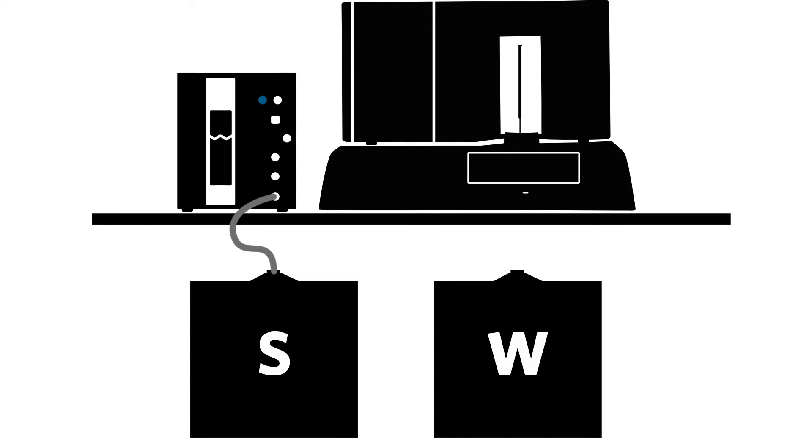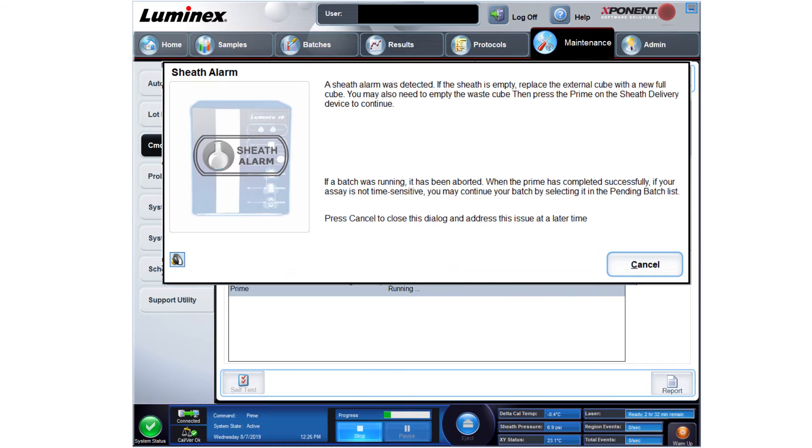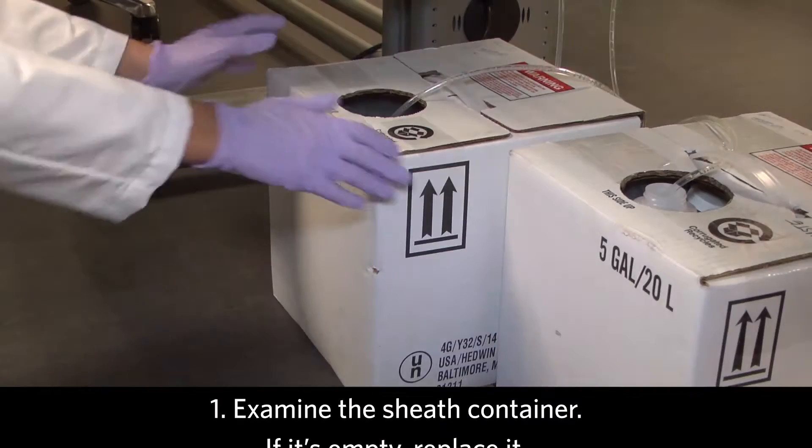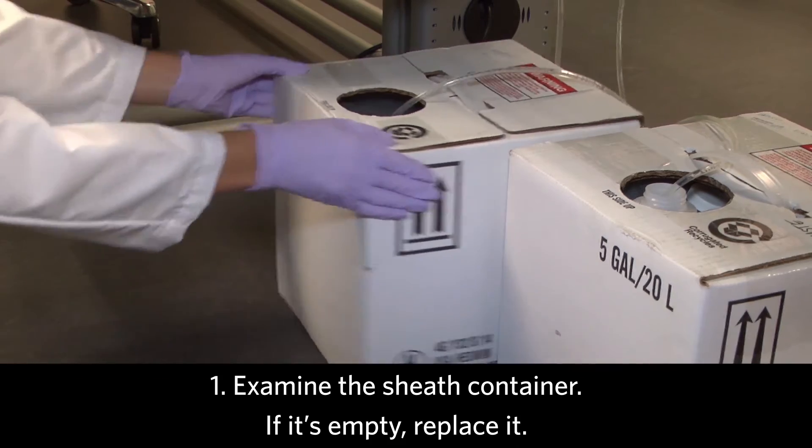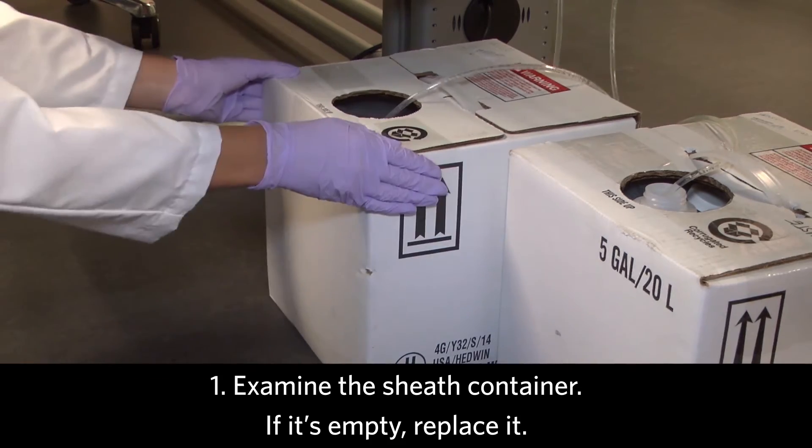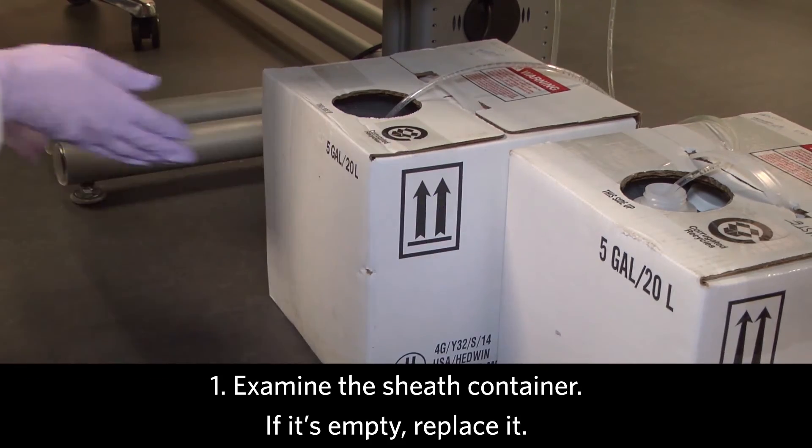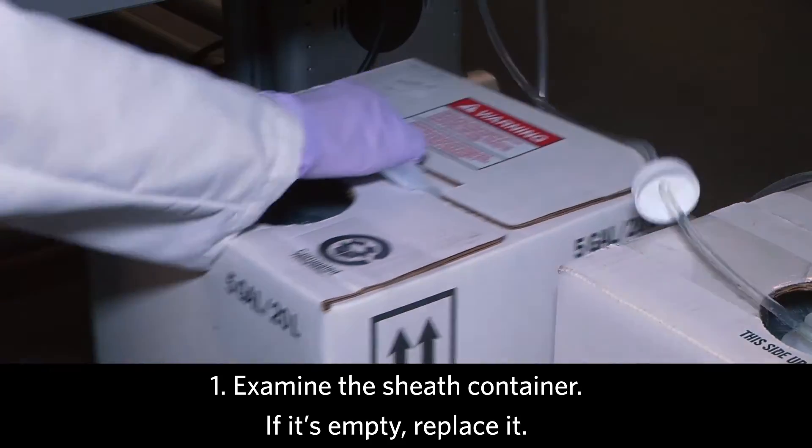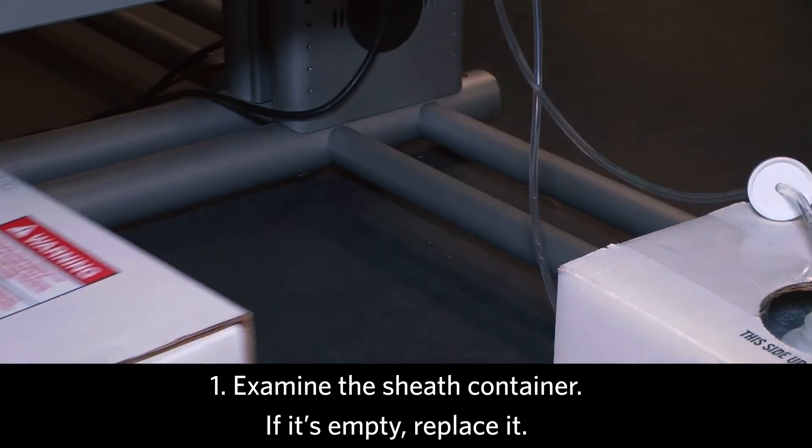In addition to hearing the beep, you will see an empty sheath warning display in Exponent. First, examine to see if the container is empty. If so, replace it.